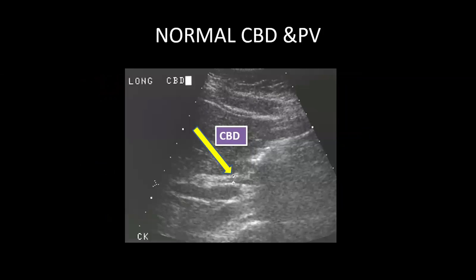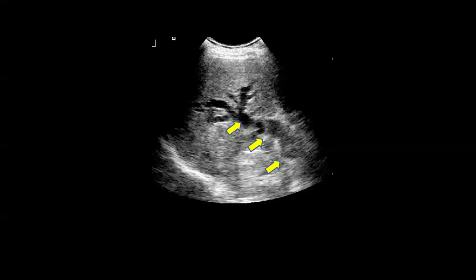Here we have an example of ultrasound. You can see this is liver, this black area is basically portal vein, and this is CBD. This is the area where we have measured CBD. Normally the range of normal diameter of the CBD would be between 3mm to 7mm. This is an example where we can see dilated intrahepatic and extrahepatic biliary channels.